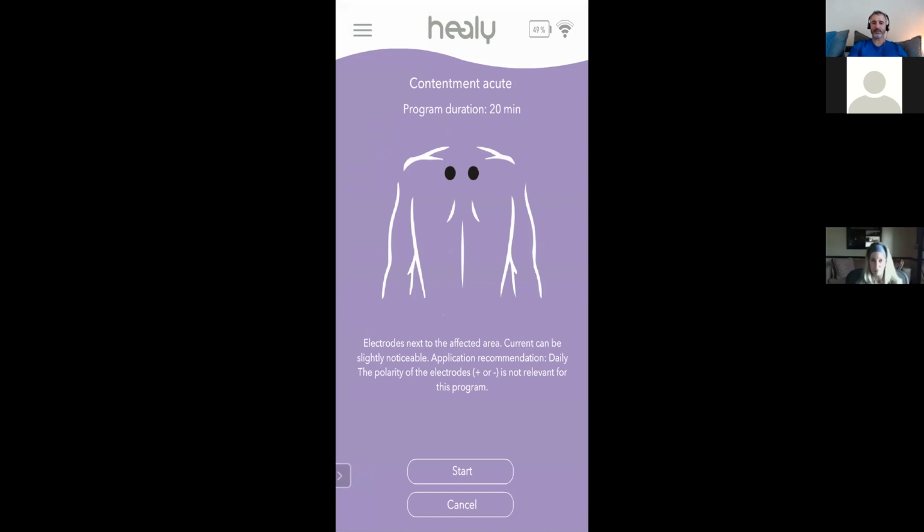Current can be slightly noticeable, okay? So if I'm not happy in my brain, why is it telling me to put the sticky pads on my upper back? That doesn't make any sense. It's a hint. This is as close a recommendation as they can give to you without telling you to use ear clips or to put the sticky pads on the back of your mastoid bones.